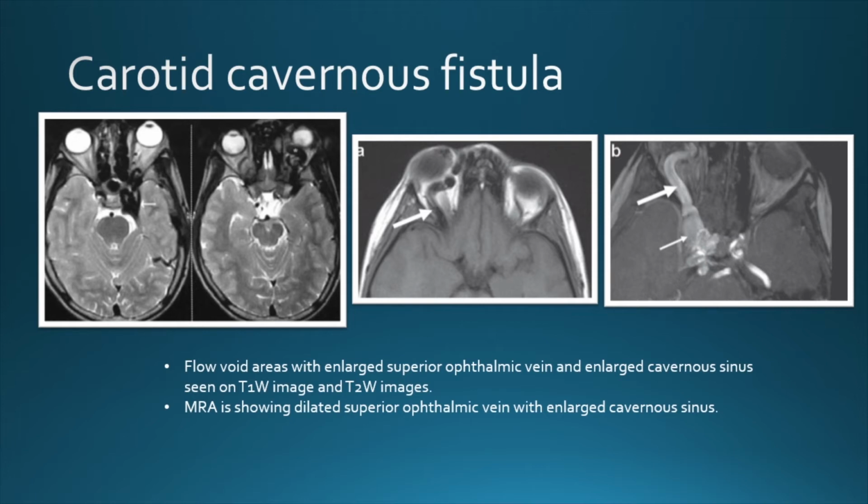Its connection to the carotid artery, because it is arterial. It is MRA. So what does it indicate when there is a bright signal? Everything is bright there, no? Communication. What all the vessels are bright. It indicates that there is a flow in that. Right. Yes. Okay. Because you can get a dilated superior ophthalmic vein in SOV thrombosis, but when you do an angiogram, you will not see flow in that. Okay, so that's how you differentiate between a patent vessel versus a thrombosed vessel.